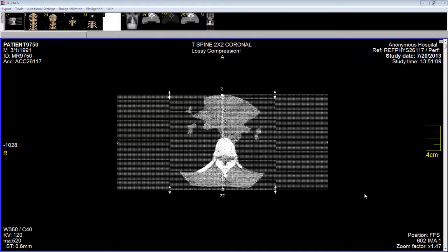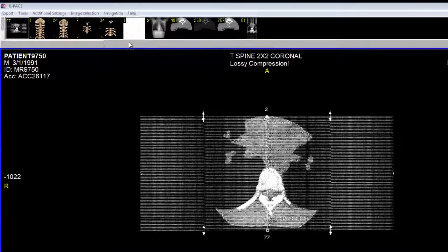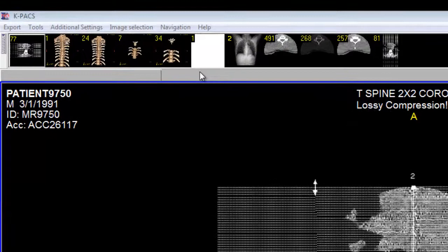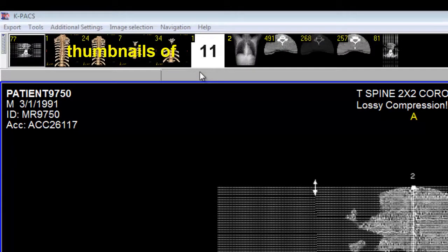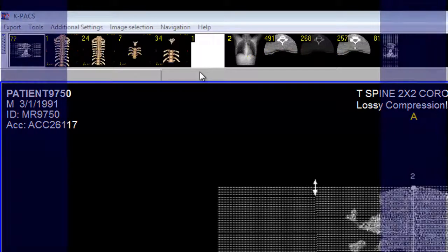This is the screen layout that KPEX uses to display the images of any patient that you load into it. I want to focus your attention to the top of the screen. Up here we have 11 different thumbnails of all the image stacks that were loaded from the patient that we are calling Normal Spine.